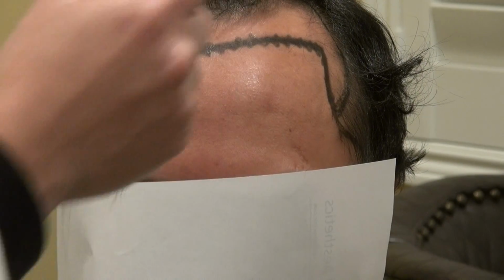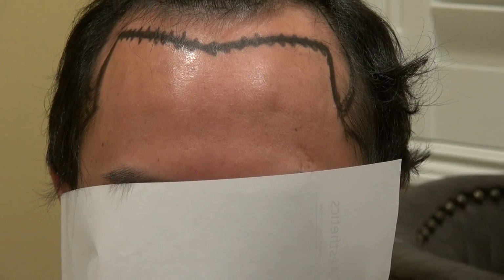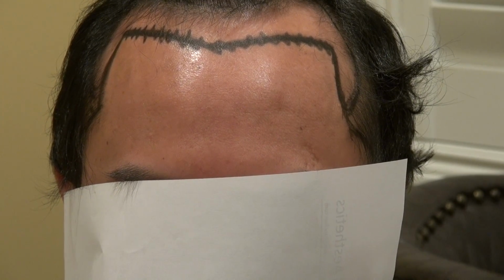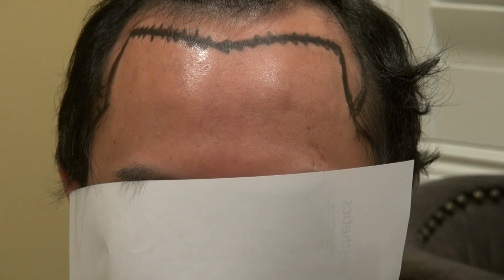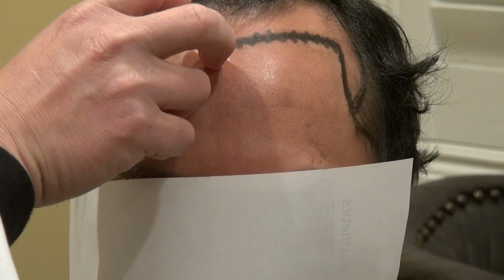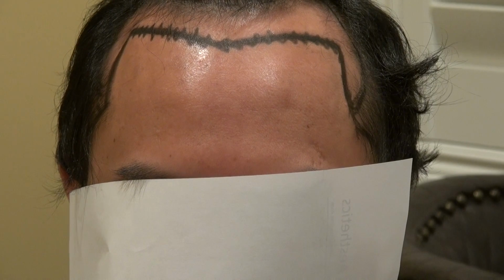From the mid eyebrow to the hairline is a third. From the mid glabella to the tip of the nose is a third. Tip of the nose to the bottom of the chin is a third. For the midpoint to the side, on average is 7 to 8.5 centimeters. Rarely 9 centimeters, but this one is almost 10, so it's too wide. So I do a lot of precise measurement from the mid eyebrow to the hairline, and from the midpoint to the temple as well. We'll be attempting at least 2,500 grafts to give the full density.